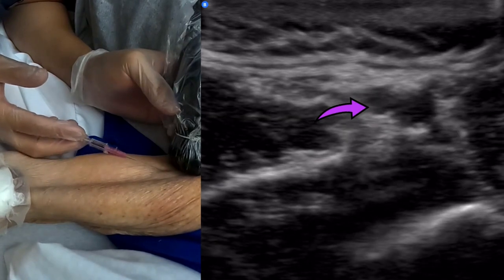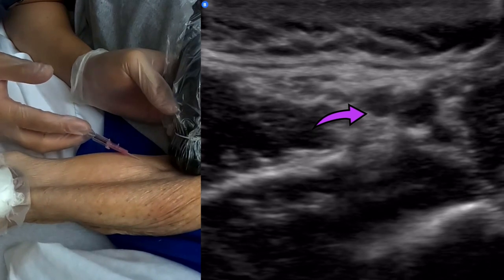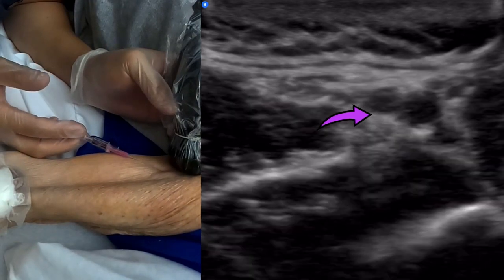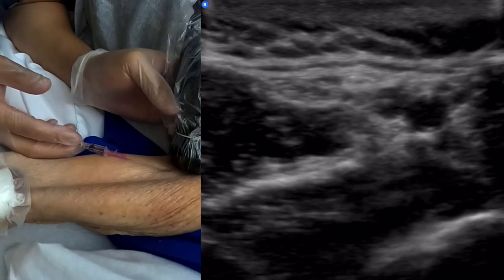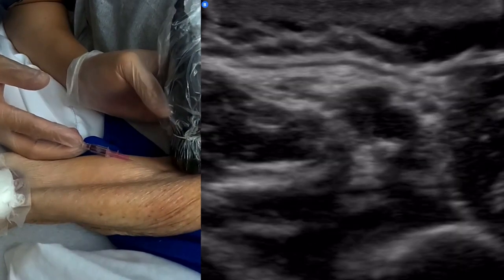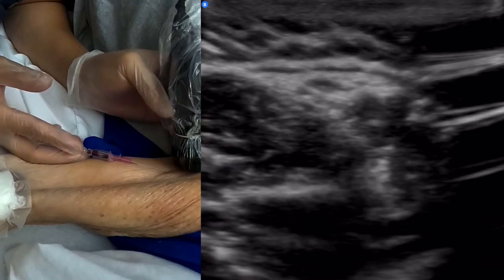Okay, again, I'm doing up, down, up, down, left, right. Trying to see where I'm at. It's almost like using a joystick. If y'all ever play video games, you see that snag? It's a little bit of a snag there. Okay, good, it's opening up, great.